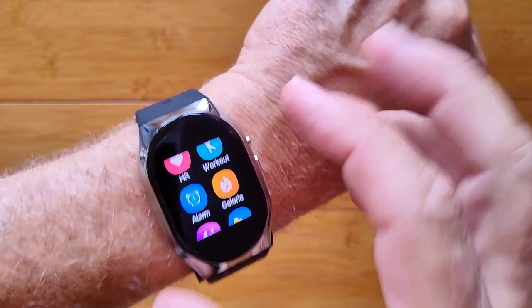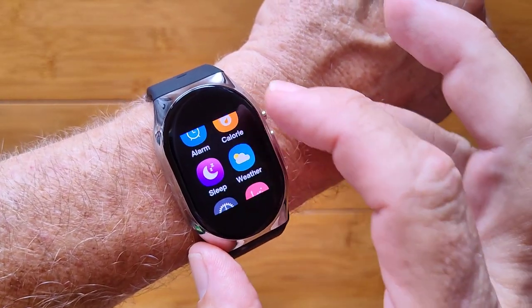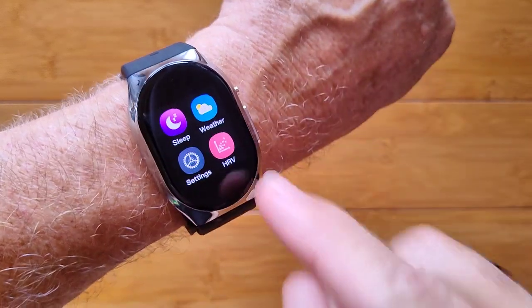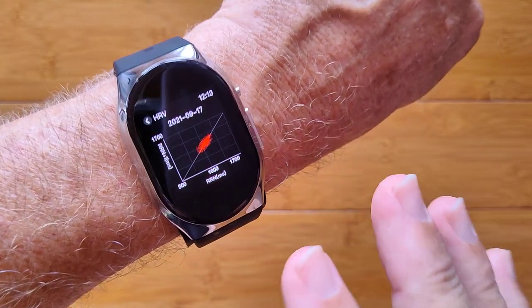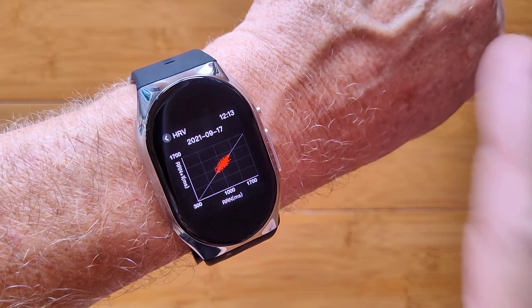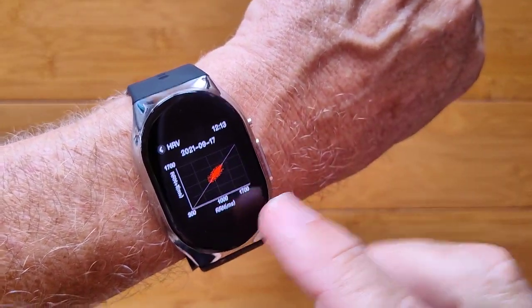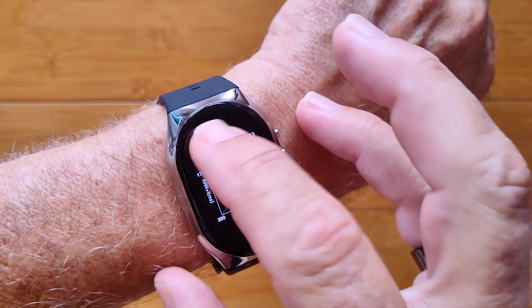You've got workouts — not many, but a little bit — alarms, count-up timers, countdown timers, last night's sleep time, weather, and heart rate variability. When you wear it to bed, you can get an actual Lorenz scatter diagram that will tell you about your heart health while you've been asleep.